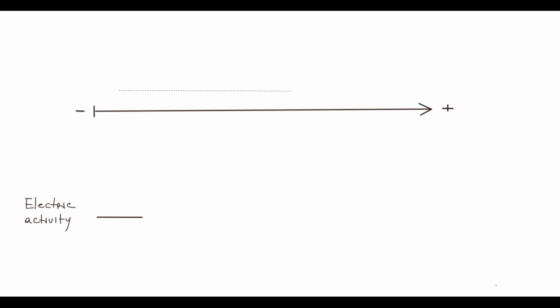If the vector is orientated parallel to the lead, but in the direction of the negative electrode, the active electrode registers significant depression from the isoelectric line. If the vector is orientated perpendicular to the lead, the active electrode will register just the isoelectric line. There will be no deflection from the isoelectric line.